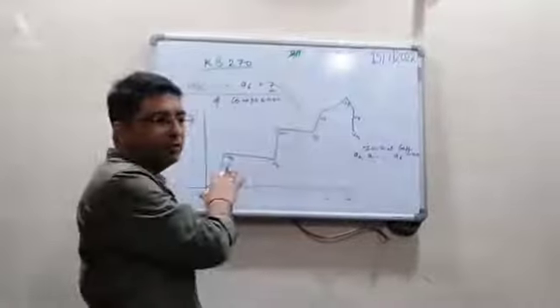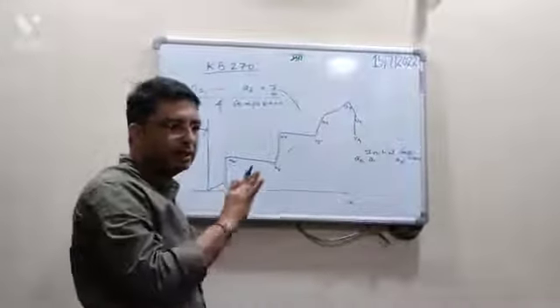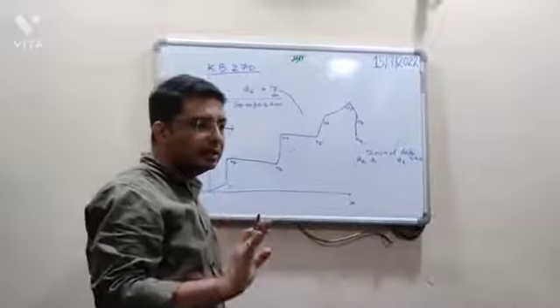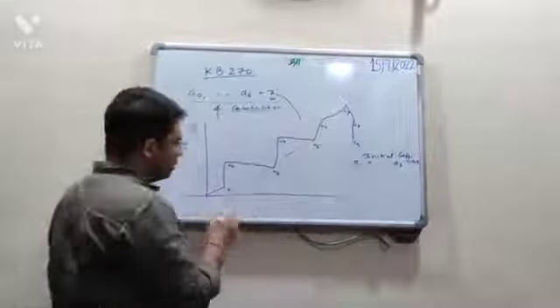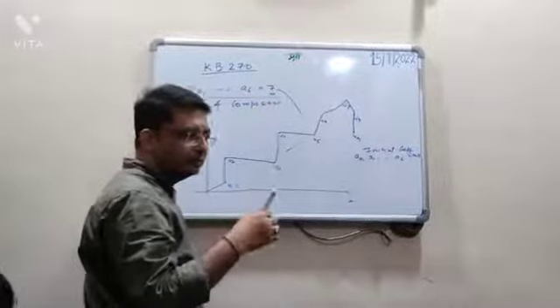These are actual values. What is our objective? Standard value. We have to tell the machine that now you have to fix the standard value. Okay, so I'll represent the standard value as a cross.